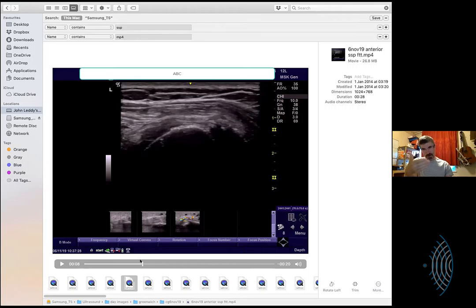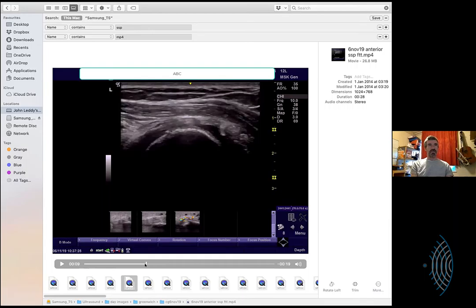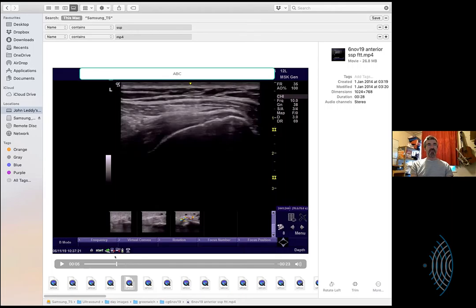Yes, that's beautiful, John. You just come back and you see the greater tuberosity reconstitute itself. When I'm scanning, I can be almost like an autistic child, making really small movements like that until I've got it exactly, perfectly parallel on the biceps tendon coming off it, or where I think is my true long axis of that anterior bundle of the supraspinatus, falling off it and coming back onto it. And that's how I interrogate that section.